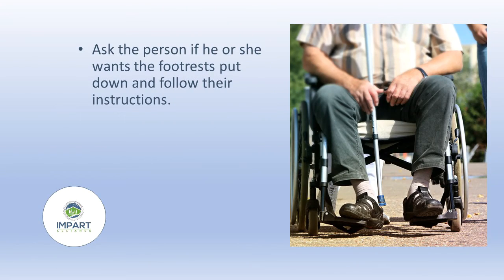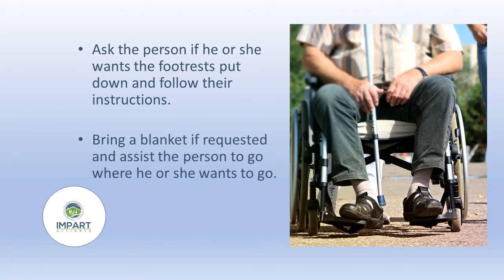If using a wheelchair, ask the person if he or she wants the footrest put down and follow their instructions. Position their feet on the rest or assist as needed. Bring a blanket if requested and assist the person to go where he or she wants to go.